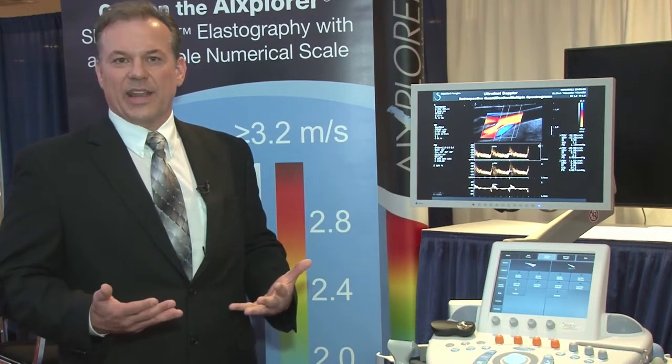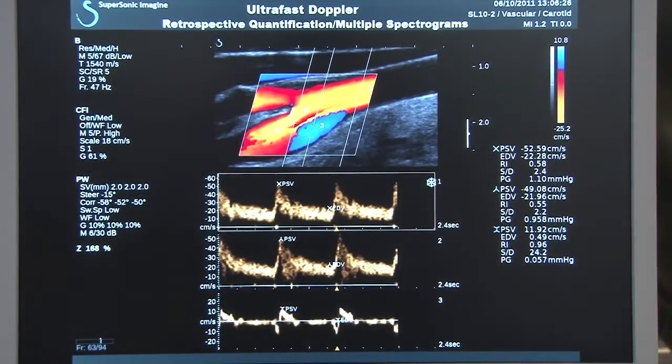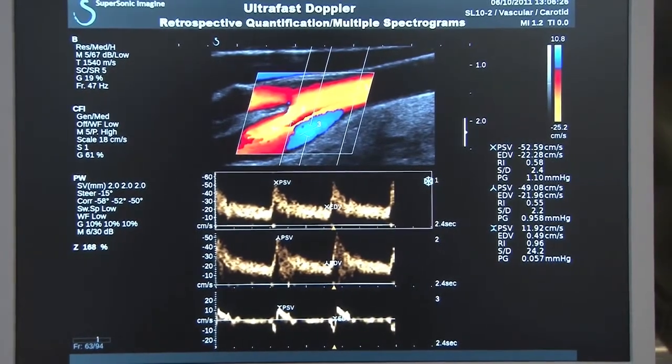You can imagine the clinical benefit: you can take a look at velocities pre-stenosis, peak stenosis, and post-stenosis, all in the same image.